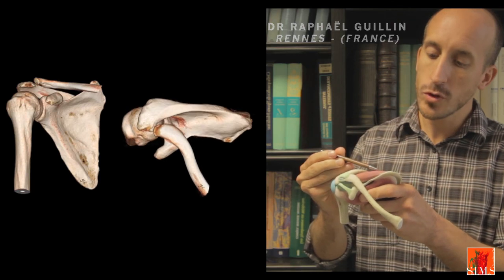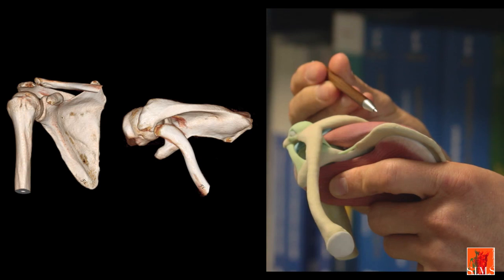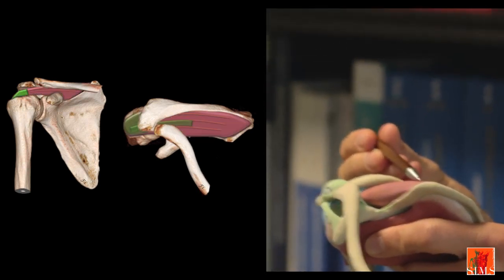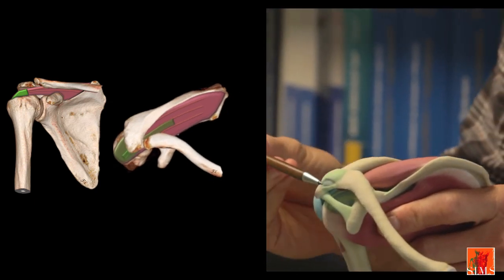The supraspinatus muscle originates from the supraspinous fossa in front of the spine of the scapula and above it. Its course runs forwards and outwards, and this is very important to understand when performing ultrasound, thus travelling under an anatomical arch which we can see here.